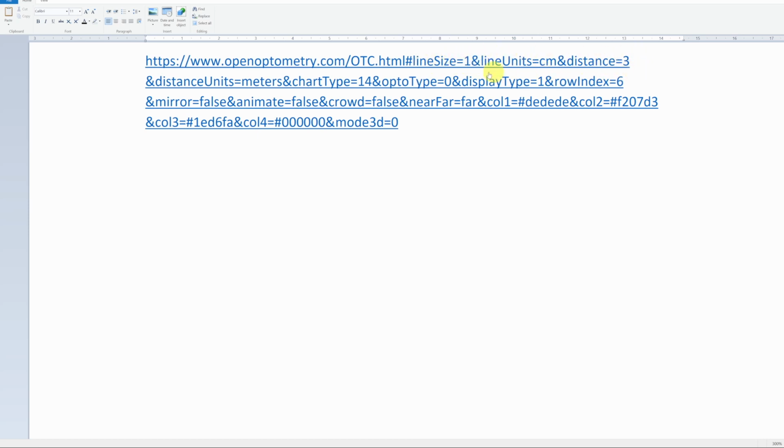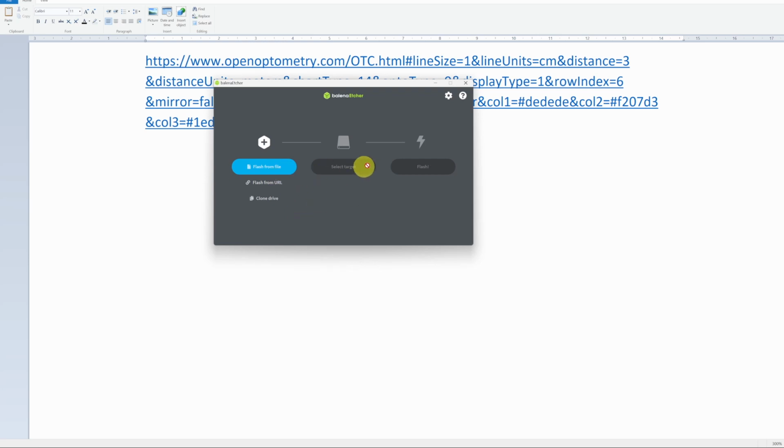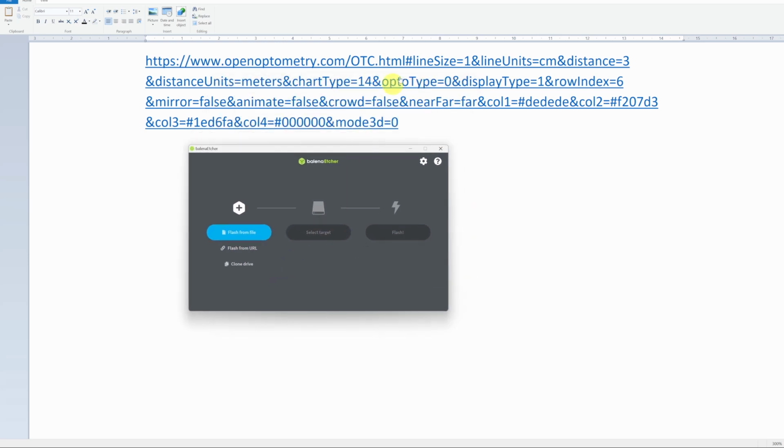So it's saved those values, and then you just adjust the URL that's on your Raspberry Pi to match this, and any of the other settings. It also saves it into this code. For example, whether you want it mirrored, so if you mirror, this will be true, but you just copy the URL from the website, or just adjust your URL in your Raspberry Pi. So once you've written the ISO using Etcher, so you've used Etcher to put it onto the Raspberry Pi, just go into the HTML file and you can make these adjustments depending on what the distance of your room is, and you can calibrate it accordingly.